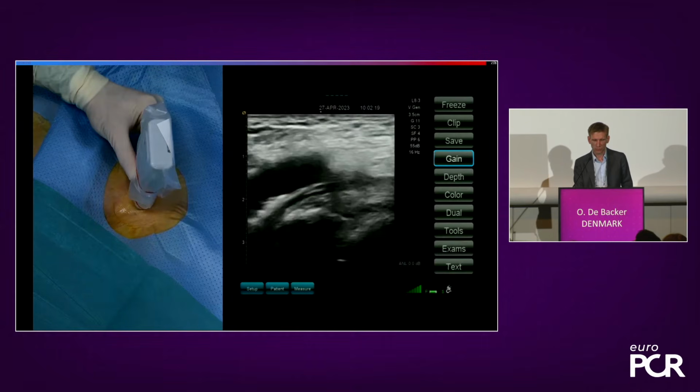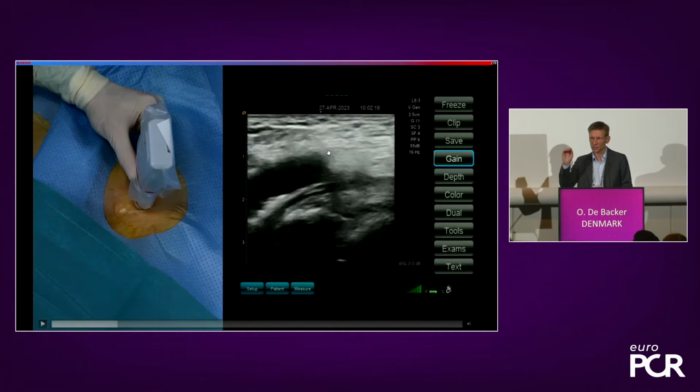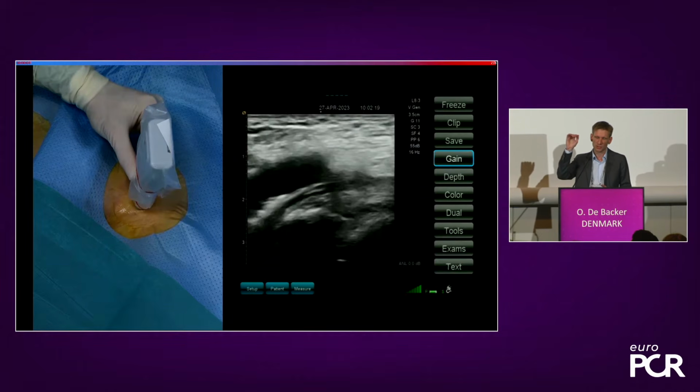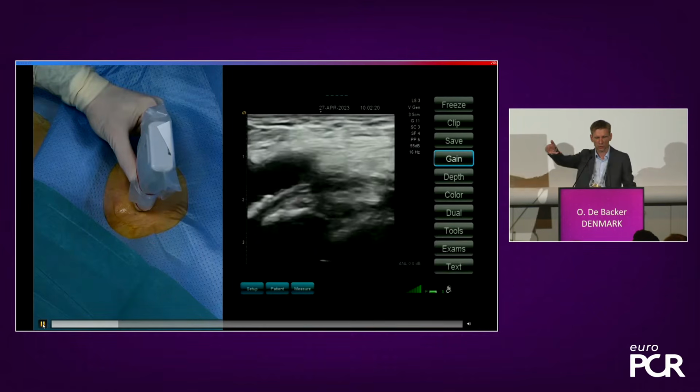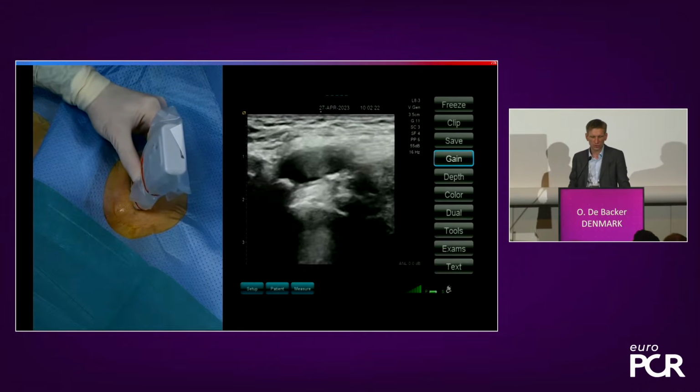So what I want to do is my puncture right here. I want to puncture quite high, but not in the part that goes down, that dives down. So I put this in the longitudinal view in the middle of my echo view. And once I have centralized the part where I want to puncture in my longitudinal view, I will clock my echo, so I will get a short axis view.